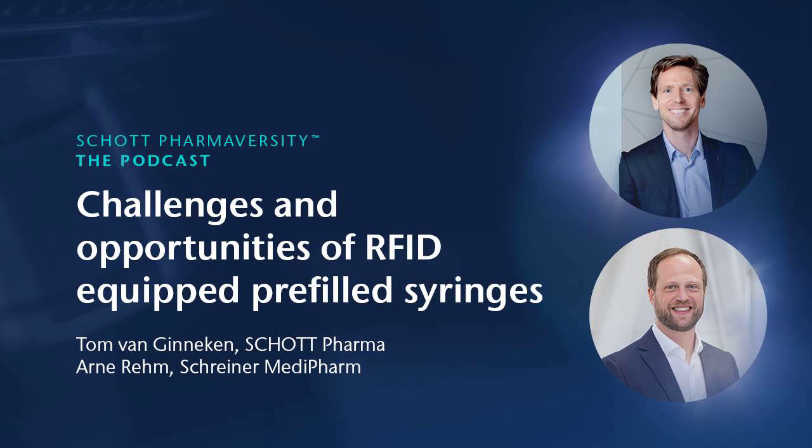Another example is also the smart syringe as a great help in digitalizing patient records. The current practice here is that healthcare workers need to manually log which drug they have given to which patient. This process can all be automated with scanning the syringes and the patient file. So no manual writing means saving time and reducing mistakes.